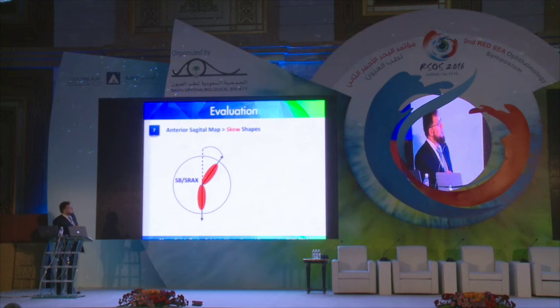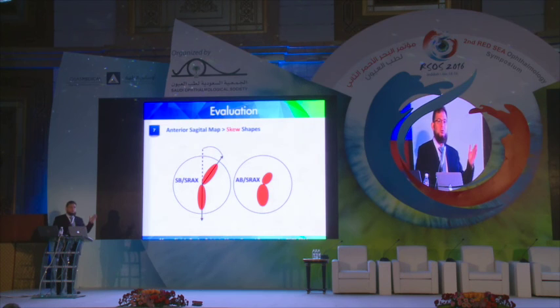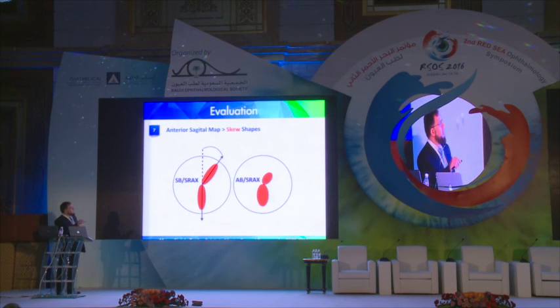The skewed shapes, we have 2 shapes: the symmetric bow tie with skewed radial axis and the asymmetric bow tie with skewed radial axis. Also, we used to say that these are abnormal, but they are normal when the difference between axes, as you see, is less than 22 degrees. When the difference is above 22 degrees, they are abnormal.